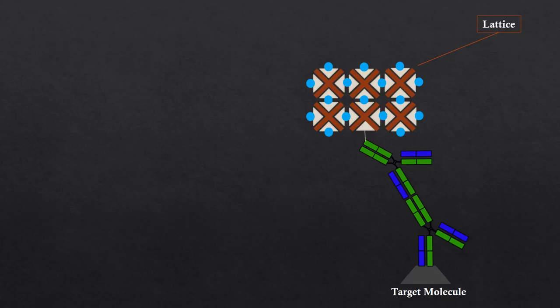Avidin is a molecule found in egg whites and is readily available. Avidin has 4 binding sites for the vitamin biotin. Biotin can be conjugated with label molecules, such as HRP. Therefore, the HRP conjugated biotin attaches to the avidin in 4 locations. The HRP molecules then cross-link with other biotin-avidin complexes to create a lattice.